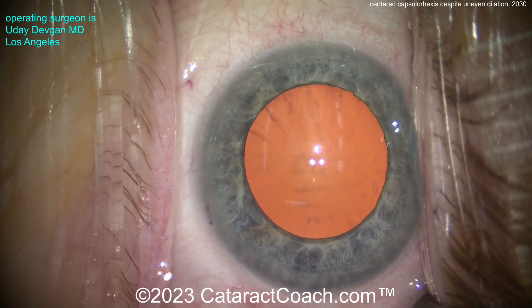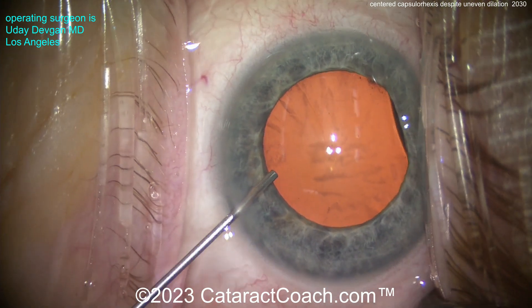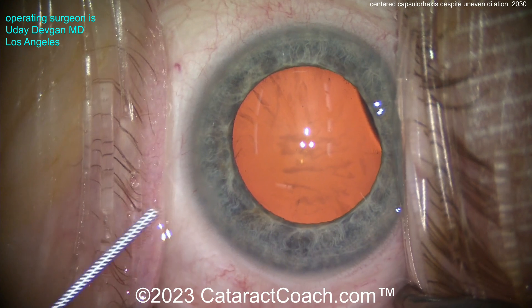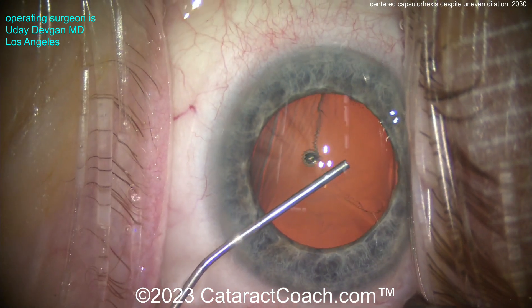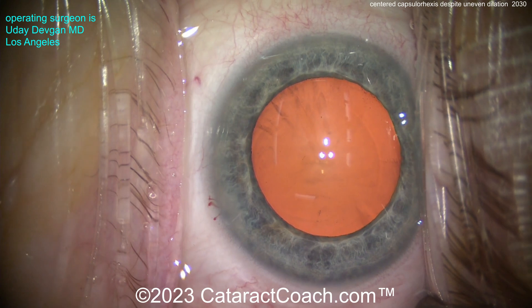Let's start the case here. Now you're thinking, that's pretty good dilation — it looks pretty symmetric here. And most of your cases do. But remember, some patients like this one can have a bit of a floppy iris, and you'll see as we start the rhexis, that's going to change a little bit. There's the anesthetic inside the eye, and here comes the viscoelastic dispersive agent getting a nice fill of the anterior chamber. The pupil looks pretty symmetric, good dilation.